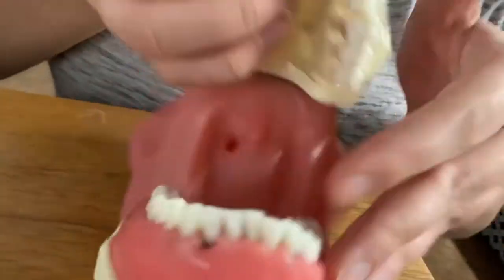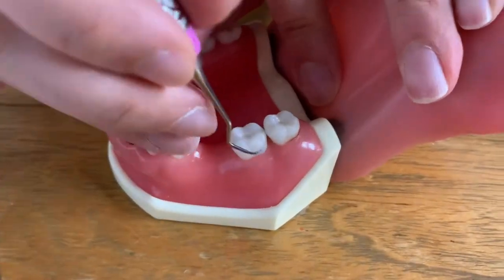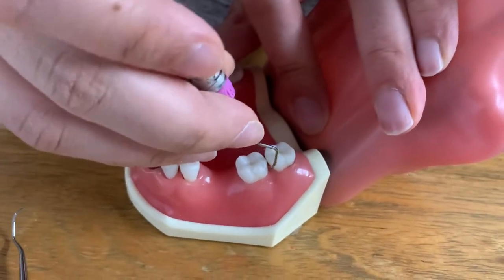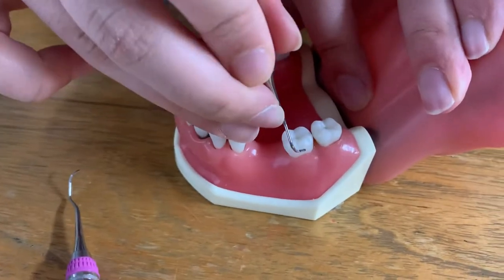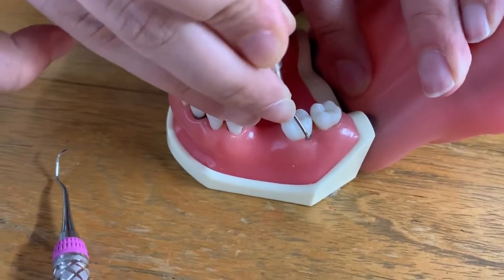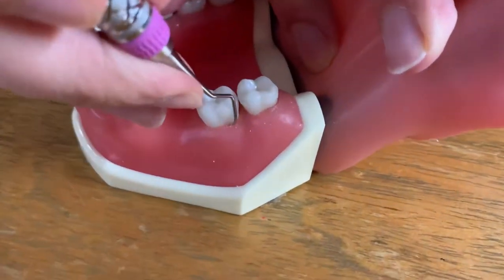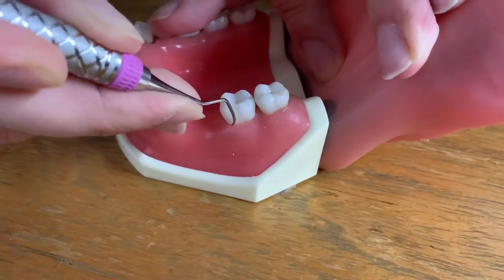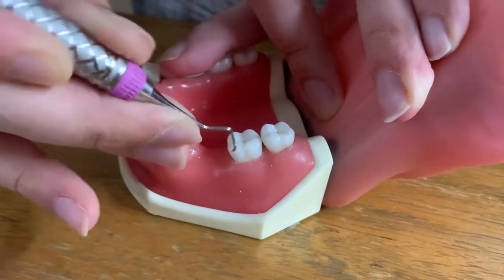Now we're going to do it for the lower left. We can see that we have a missing tooth right over here, so I'm going to have to fulcrum a bit farther away. We're going to find the correct working end — I'd have to flip the instrument over here. The V is pointing distally once you put it interproximally. I'm going to insert, open, activate. Flip it around, insert, open, activate at 60 to 80 degrees once again. End up interproximally.